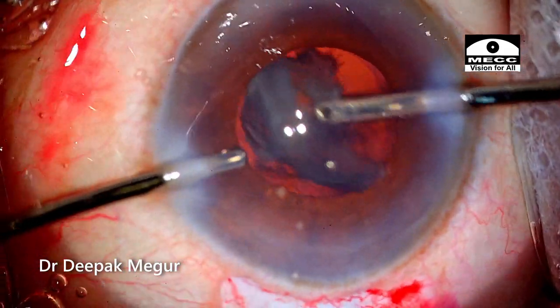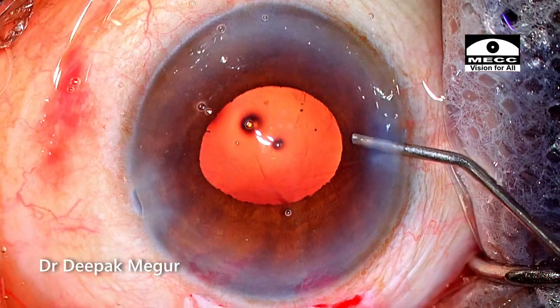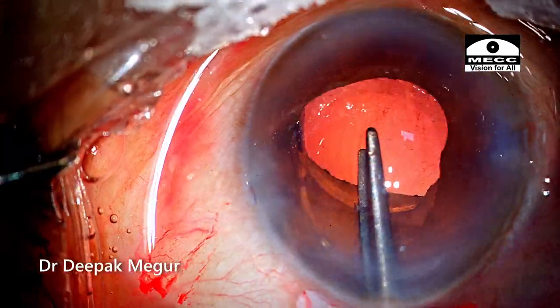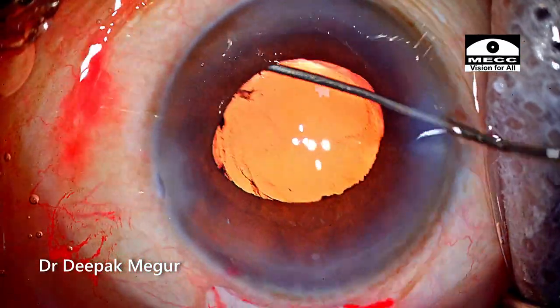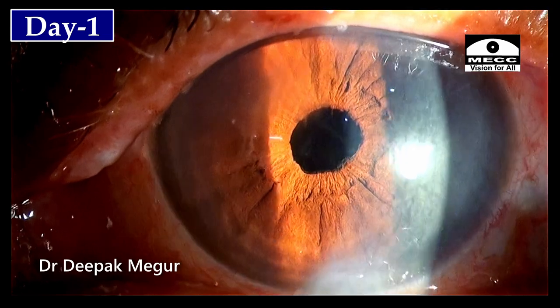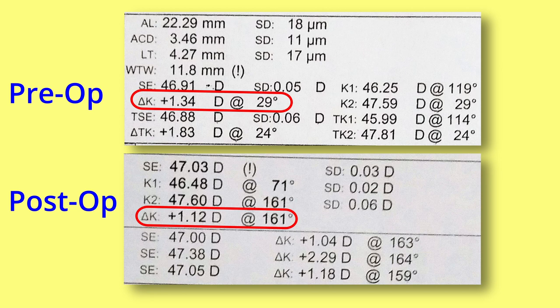The epinucleus is flushed out, the cortex is aspirated, and the intraocular lens is placed into the bag. We have a nice secure temporal wound which produces very little astigmatism in this patient.